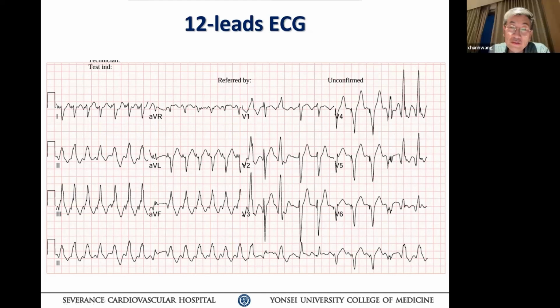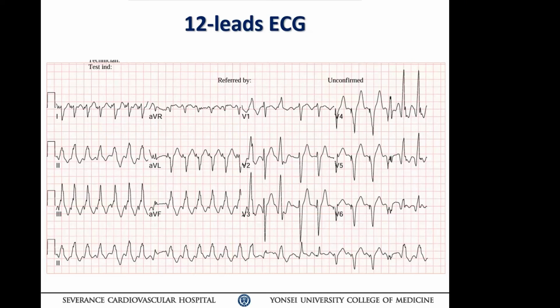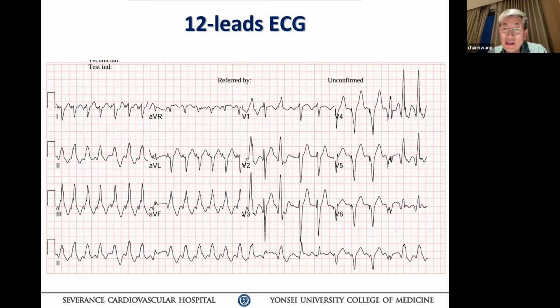Yeah, let me explain this. If this patient had right bundle branch aberrancy, and if you pace at the same time and get fusion, what would it be? You pace the right ventricle, would be what? Left bundle. If the timing is correct, fused together, it gives you a narrow complex. Okay? Yeah, that is the so-called balanced bundle branch. That's correct. That is present in the last rhythm strip, called the third beat, the last one from the last three.